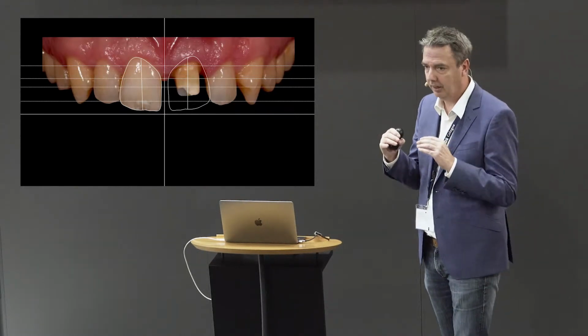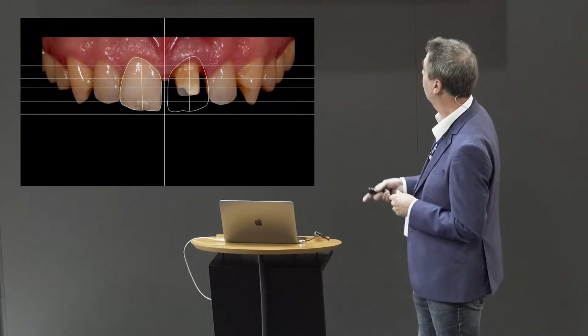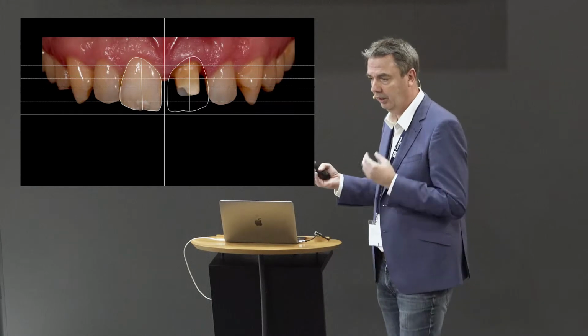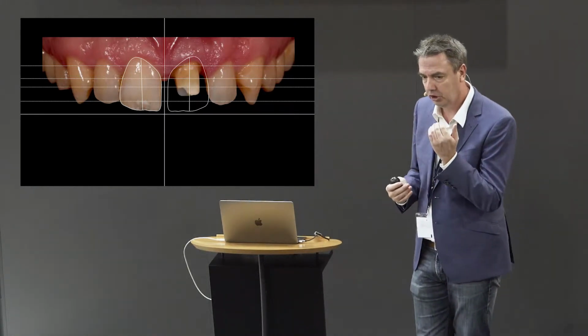And for this, it's ideal to work with the plane finder, because this is the desired shape. If we don't do this and the patient goes into protrusion, he will definitely fracture the incisal ledge.